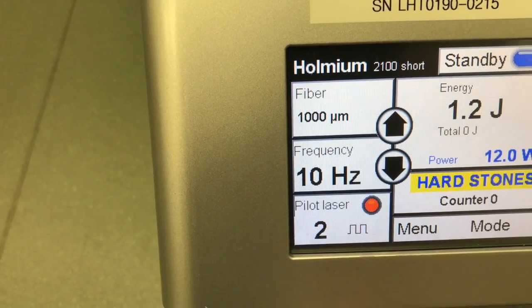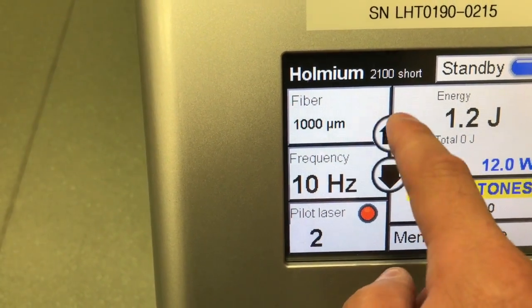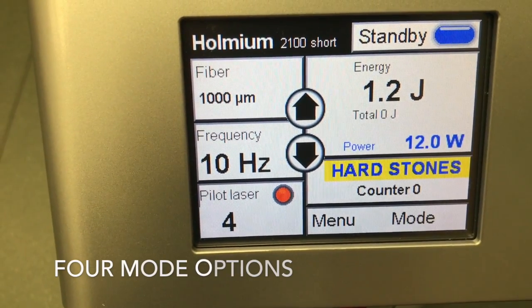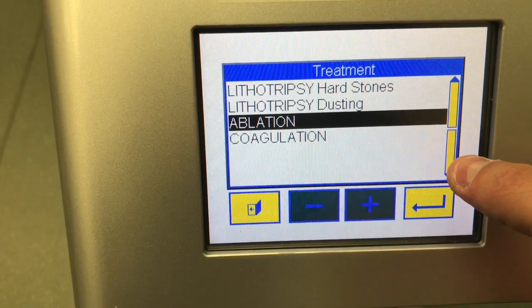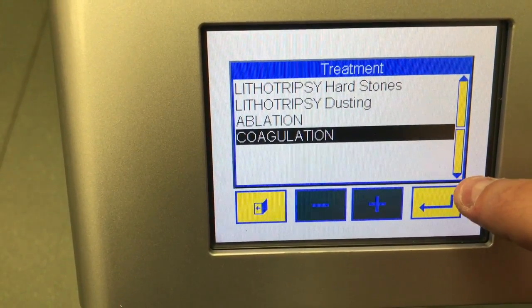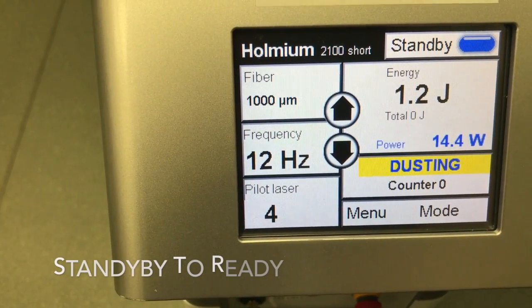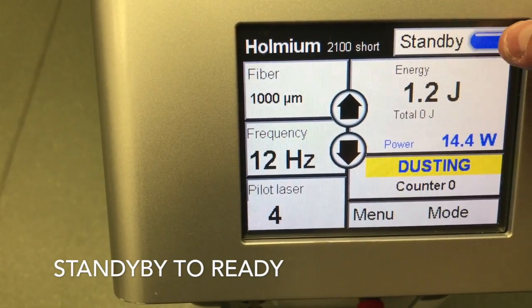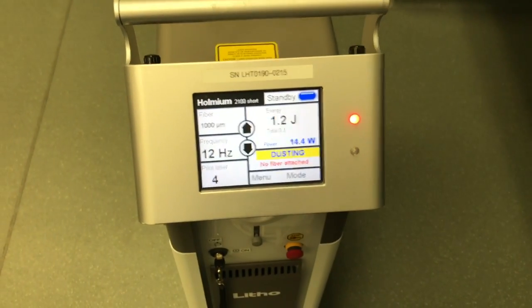The pilot laser is the aiming beam — it shows as a solid beam, and that little line signifies it's pulsating. For mode, this is currently in hard stones mode; you can also go into dusting, ablation, and coagulation. From there you're ready to go from standby to ready, and that is it.